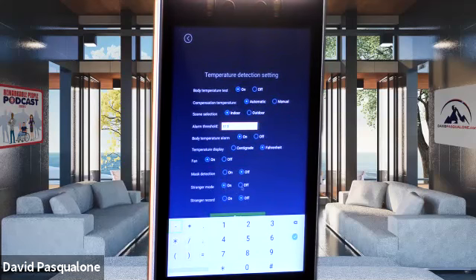Stranger mode is when you want that off or on. If you have stranger mode on, that means anybody can come into your facility. It's just going to scan temperature and say approved or denied. With stranger mode off, it only allows people in your organization who you've already pre-scanned, registered with facial recognition, and set into your database. Same thing with stranger record. If you have it on facial recognition only and someone walks up who's not identified, do you want the stranger record to be kept or not? So that's what we're dealing with here.